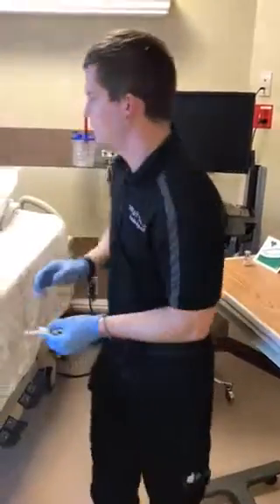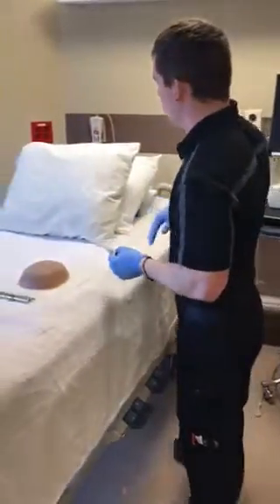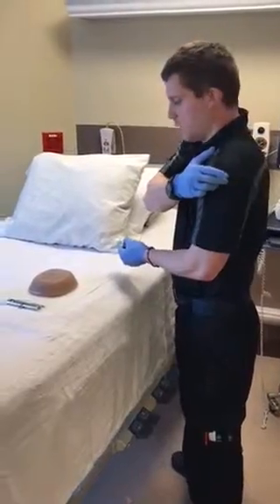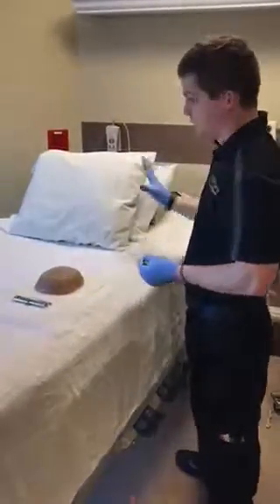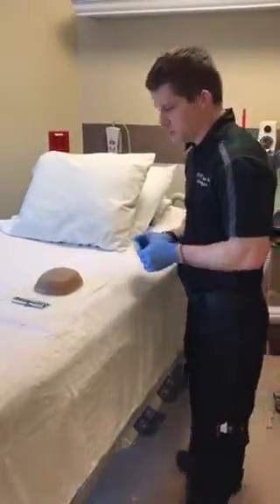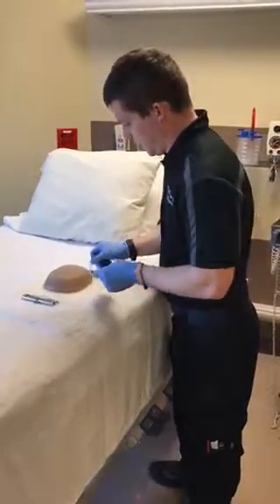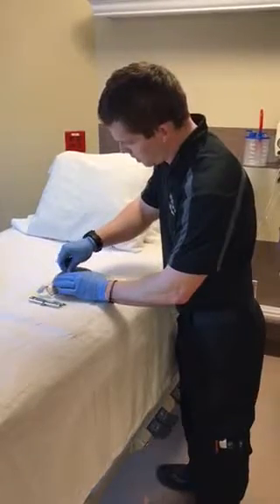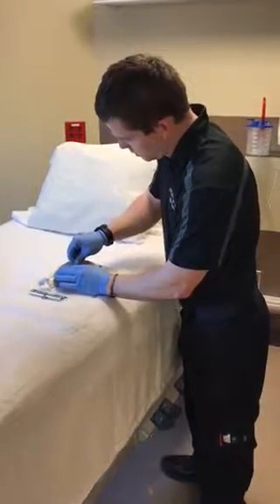We're going to select the right site, which is the left deltoid. We're going to be measuring 2 finger widths down from the acromion process and putting it right there. Unfortunately, Bob's arm has to be down flat on the bed, so we'll make do with what we have. I'm going to cleanse the site once I locate it, 2 fingers down from the acromion process. Cleanse in a circular motion.